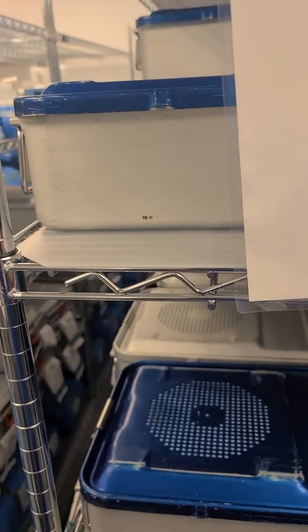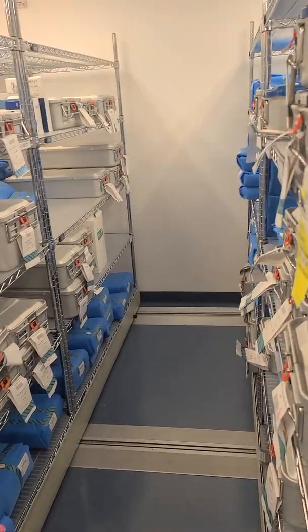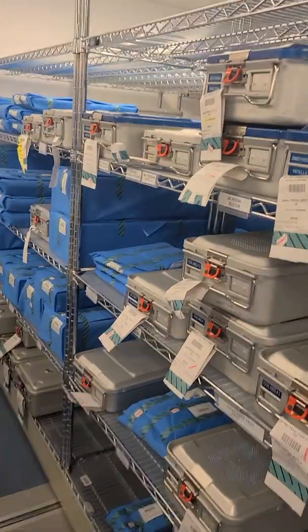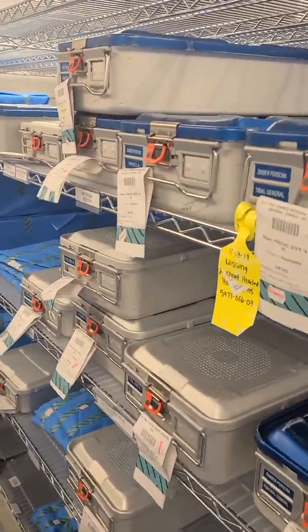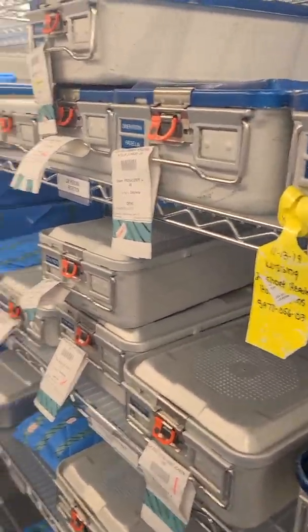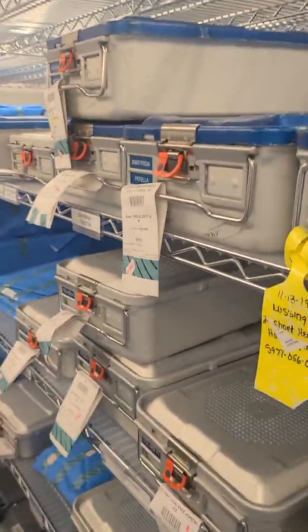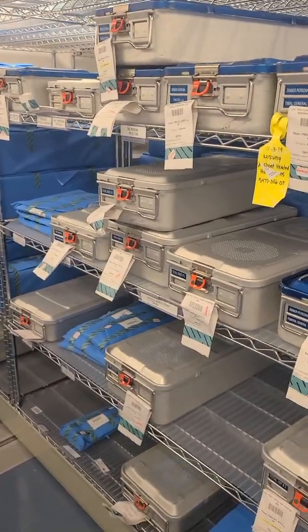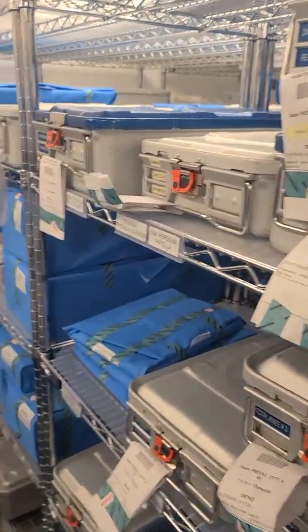It also tells you how to transport items to and from the sterile storage area. If you are to transport sterile items into an area that is not environmentally controlled, it should be transported in an enclosed case cart or covered in some way. There are sterile cover barriers — like this one right here — that you wrap your items in to take to the area you need.